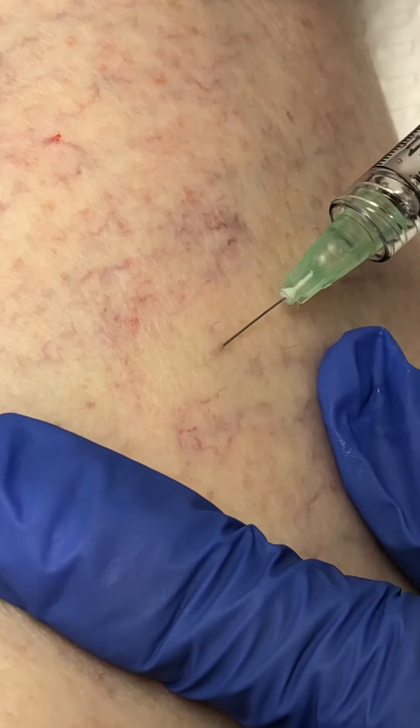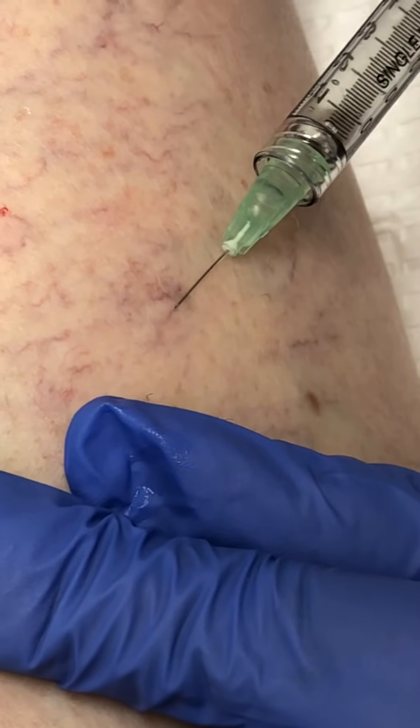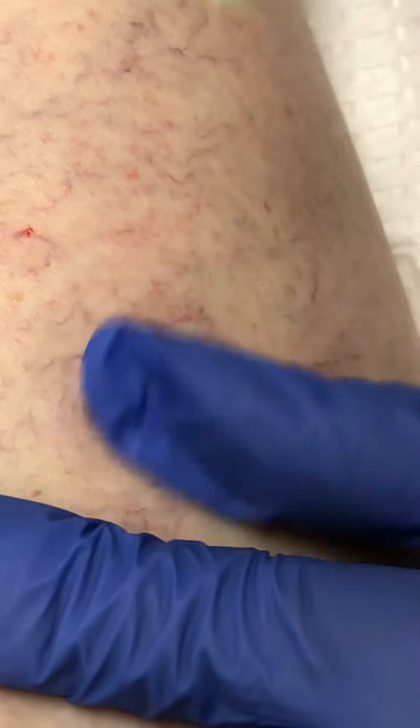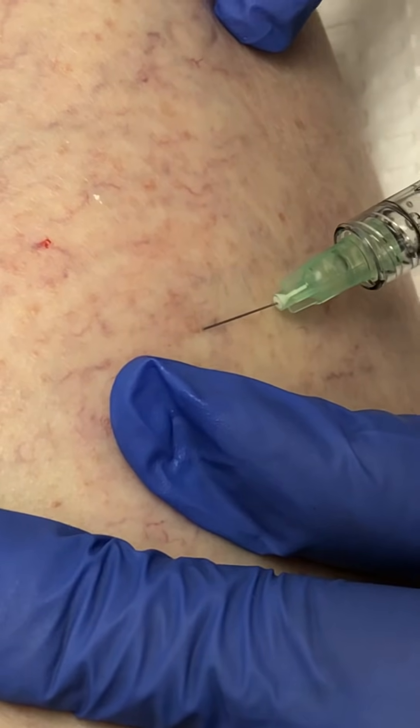I inject about 0.1 or 0.2 cc's per injection point, and I don't have a particular pattern that I follow. I just look for a vessel that I'm sure I can get into with my needle, and as you can see, we're very effective at accomplishing that endpoint.